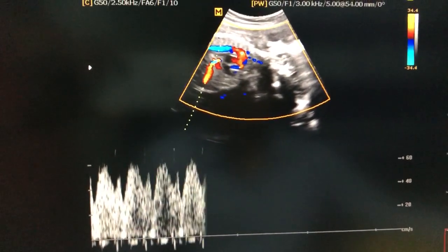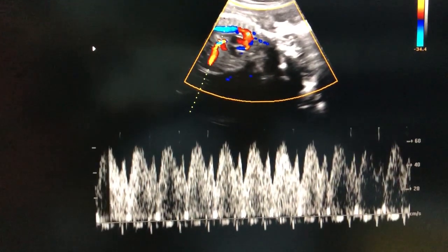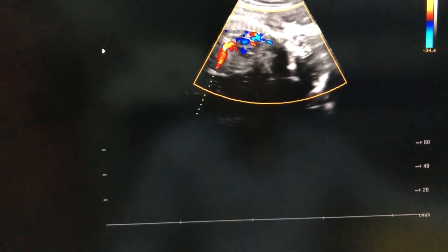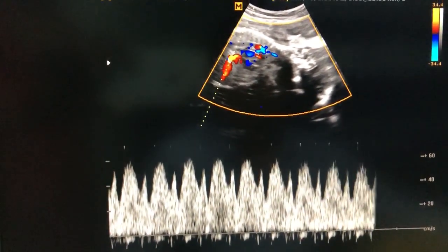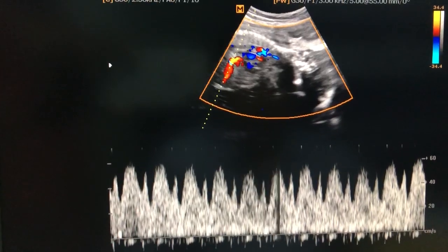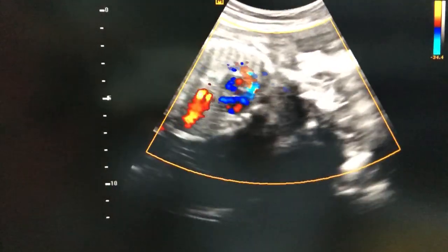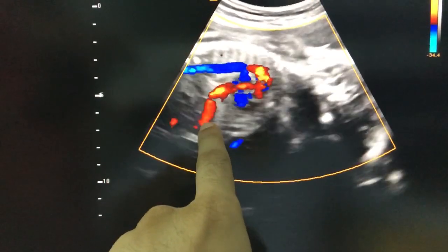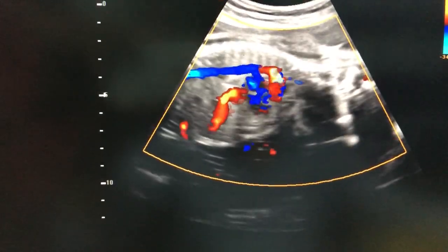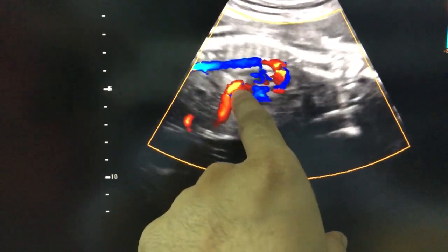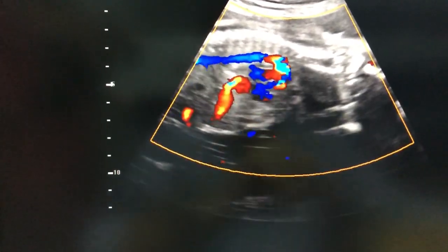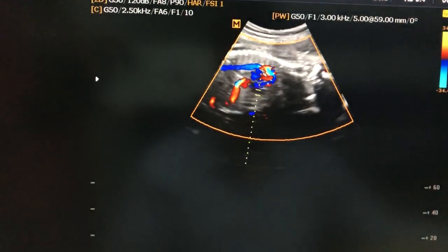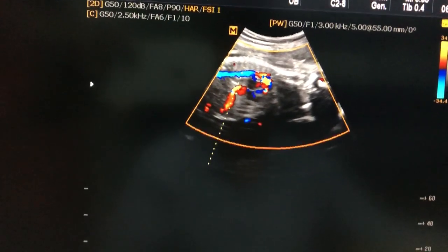Once again, how to identify: take this aortic arch view and look for this kind of large vessel. See the aliasing wherever it is present. Keep the velocity at 34 — only then will you see the aliasing; otherwise, if you keep a lower range velocity, you will see aliasing everywhere.